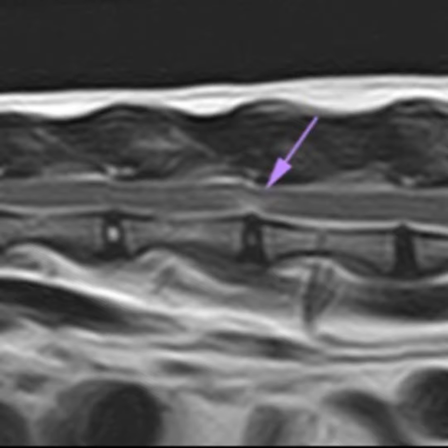Did you find that clinical outcome for cats that underwent surgery for intervertebral disc herniation was consistent with previously reported data?